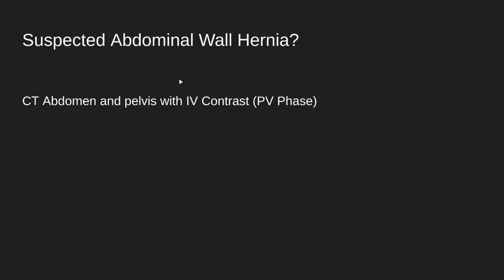And what if you suspect abdominal wall hernia? In that case, you order CT abdomen and pelvis with IV contrast, specifically portovenous phase, to assess the hernia. All right, IV and not oral contrast.